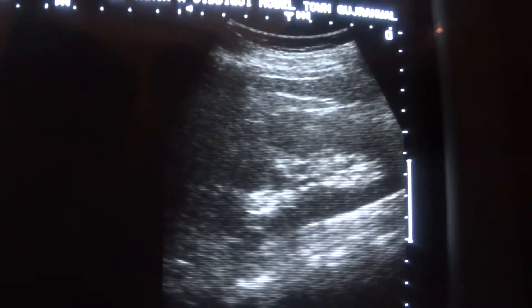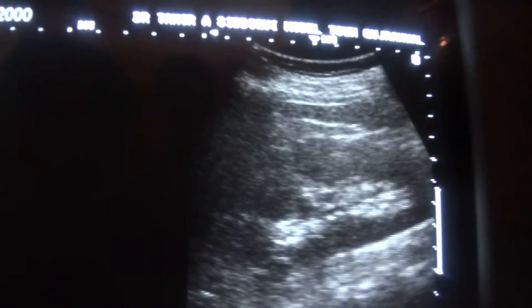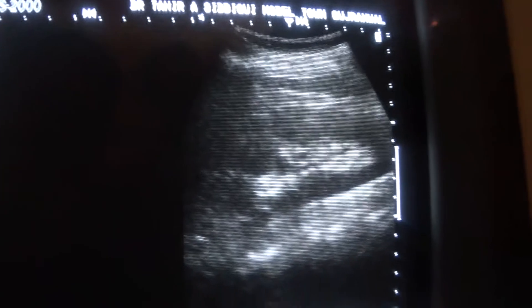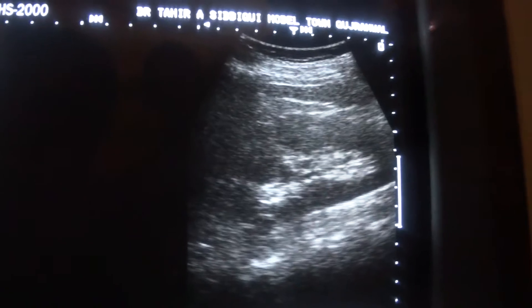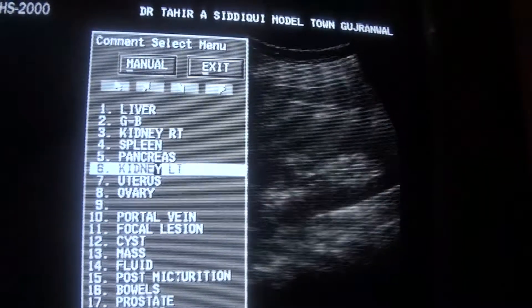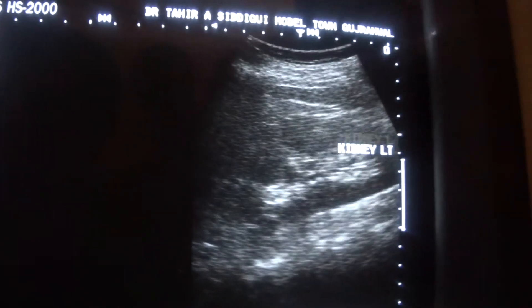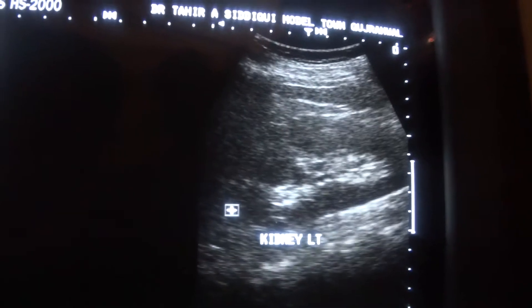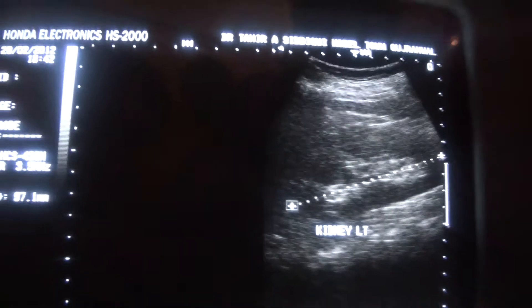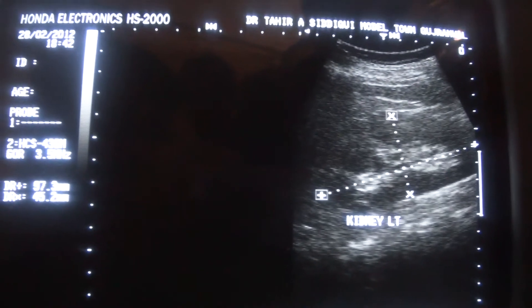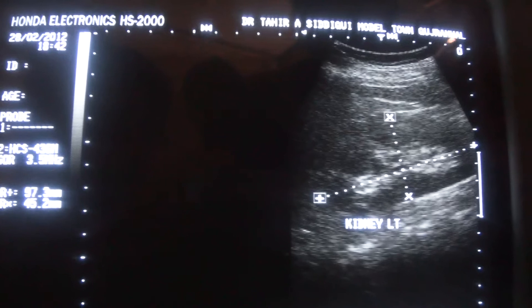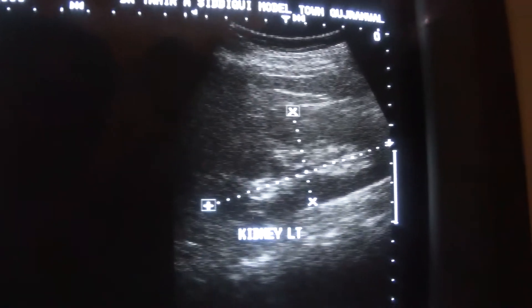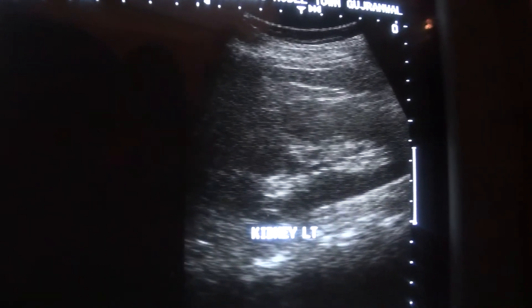On the right side of the screen I have intentionally placed the right kidney of the patient. Same patient — this is the left kidney, which is normal, measuring 9.7 cm in length and 4.5 cm in anterior-posterior diameter. So in longitudinal section the size of the kidney is normal.